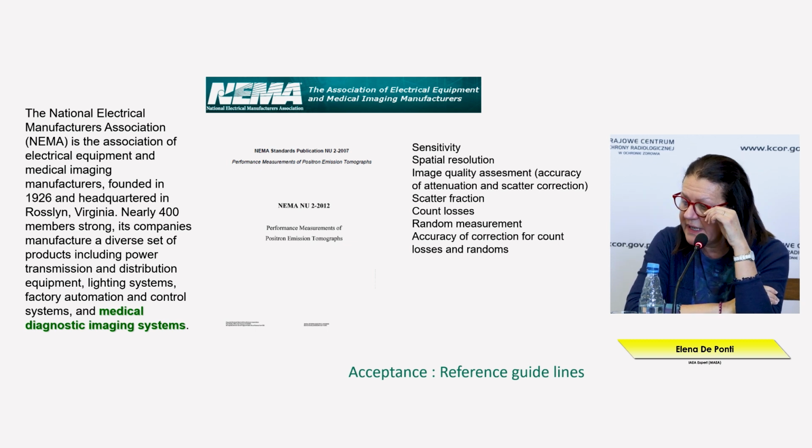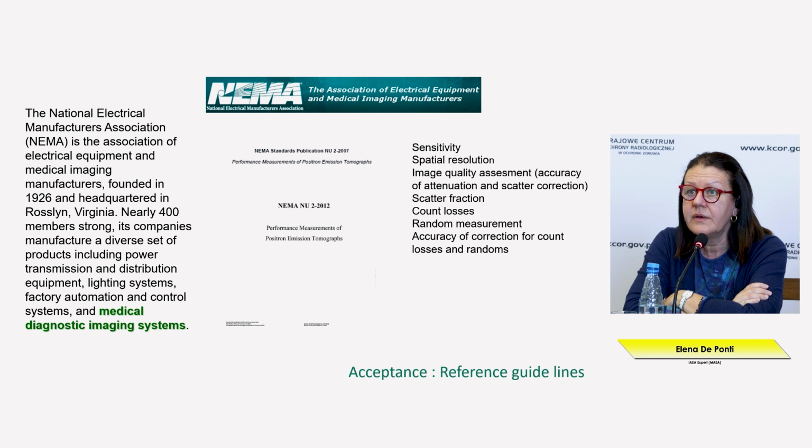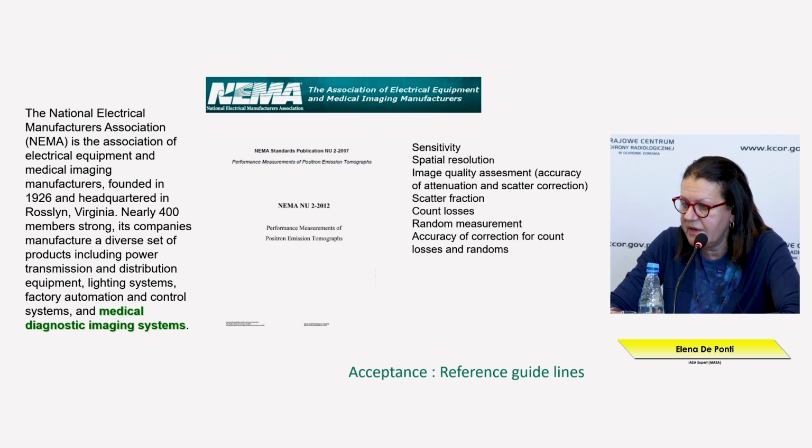These guidelines are periodically reviewed to include all the characteristics of new equipment that is put on the market, and so if new instruments or new performances become available on a new scanner, the NEMA test will take into consideration this characteristic as well, to give a full view of the new scanner.